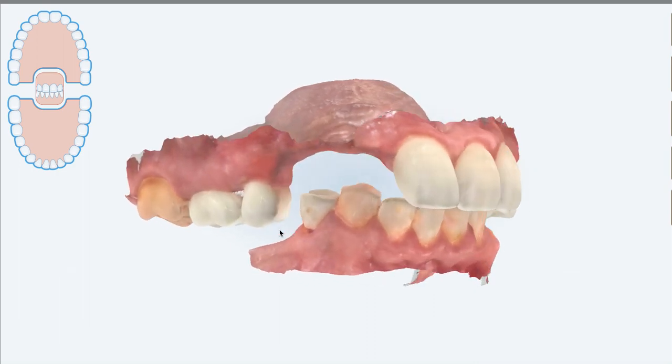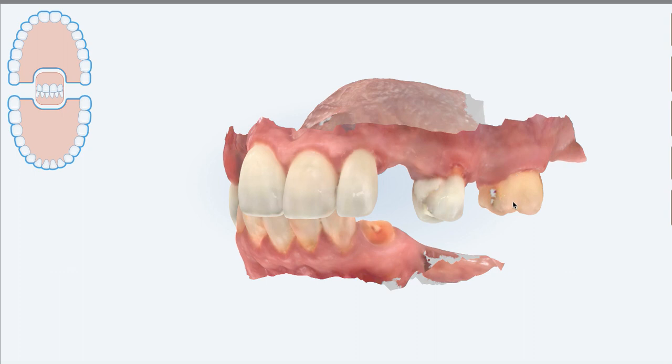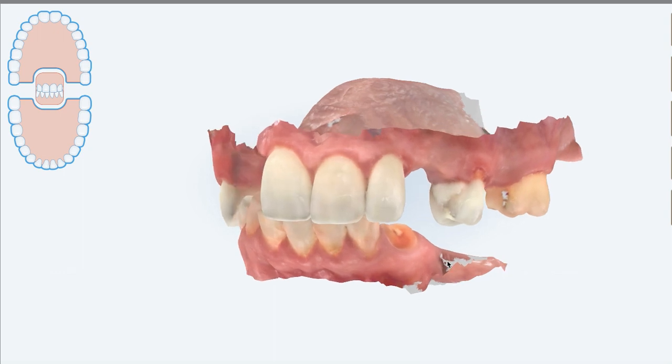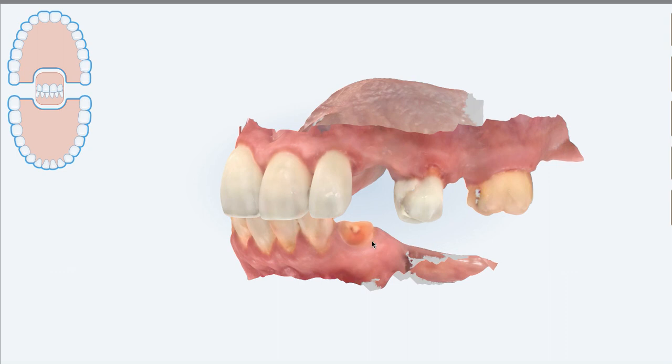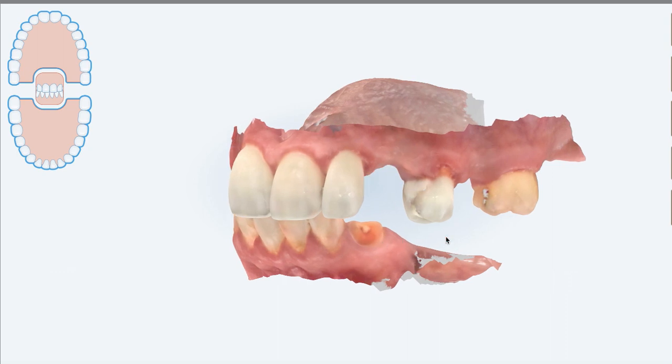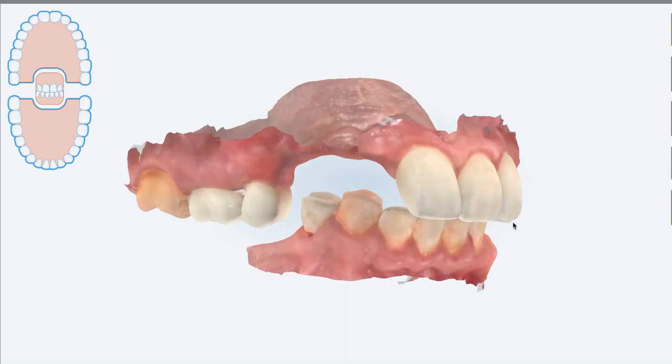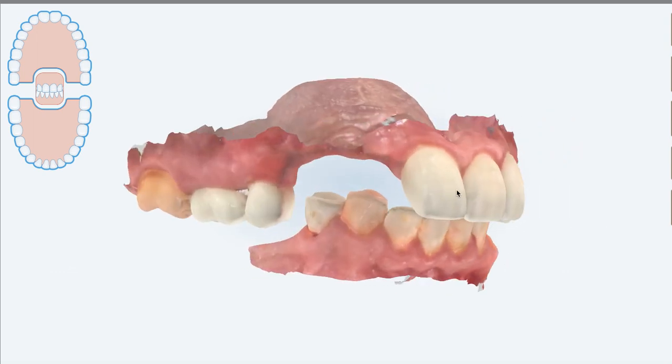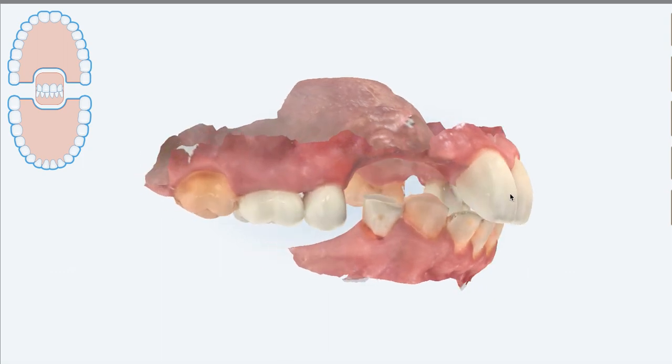As you inject, make sure that you get as far back as you can. You want to have bite material that indicates the anterior-posterior position of both the upper and lower arch all the way around. So basically, you want to have bite material from at least the first molar region all the way around. If you don't get that, then the lab may not be accurately mounting the case because the posterior section might wobble. This is getting a little better now that we're using digital dentistry. With that said, you want to make sure you capture as much as you can.